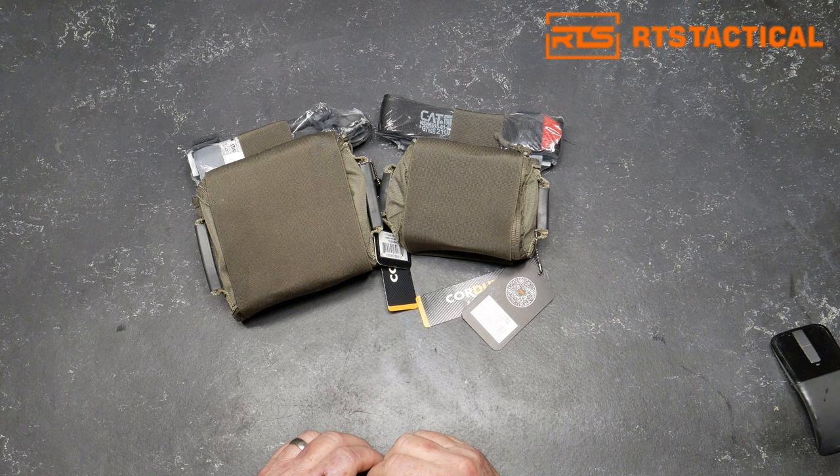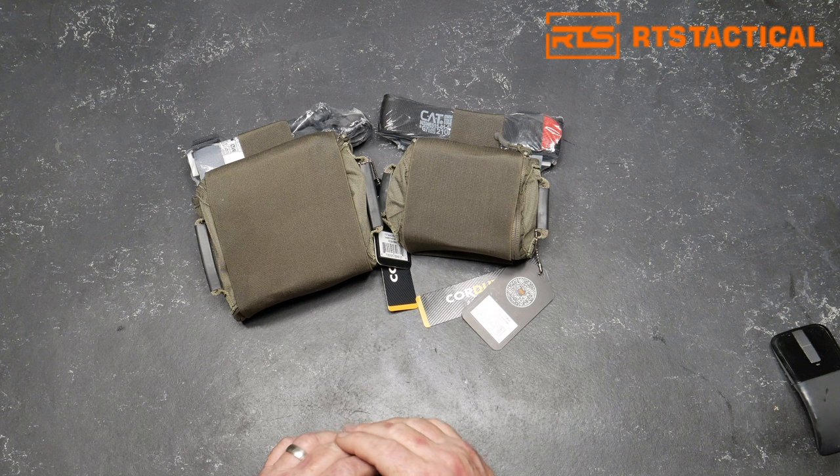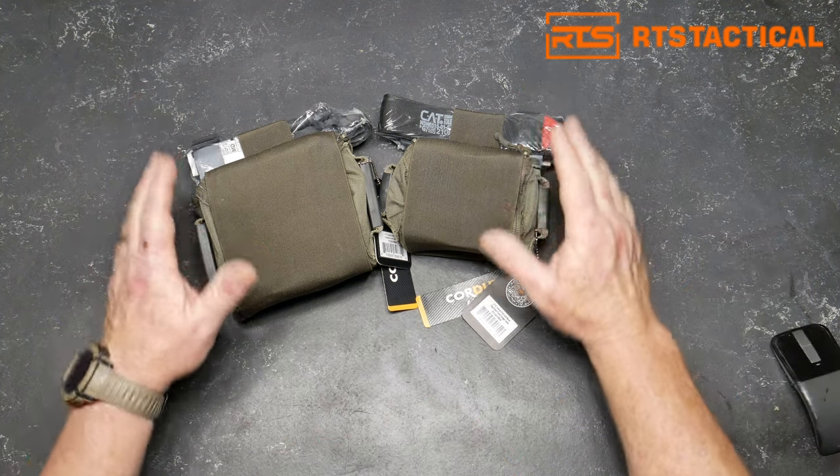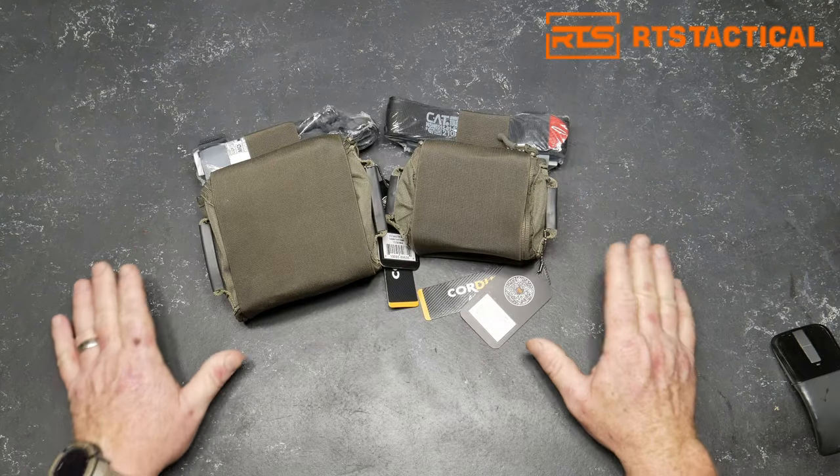RTS Tactical has been a really good partner of the channel. I've done some reviews on their ballistic shields, their ceramic plates, level three plates — there's some other stuff out there that's really, really nice. Well, in any case, they sent these things out. This is their new addition to their lineup, their IFAC.